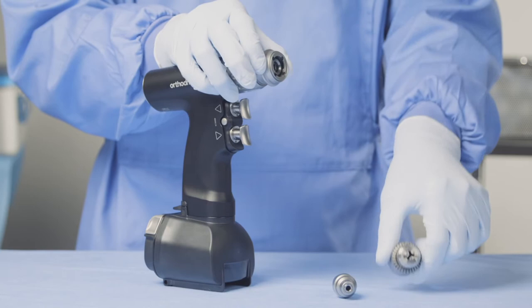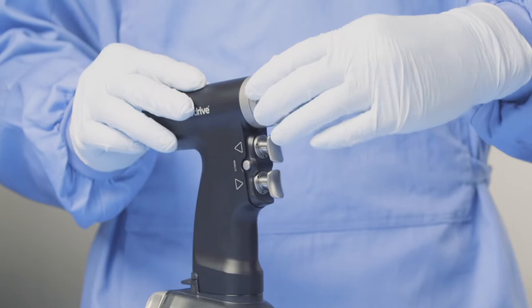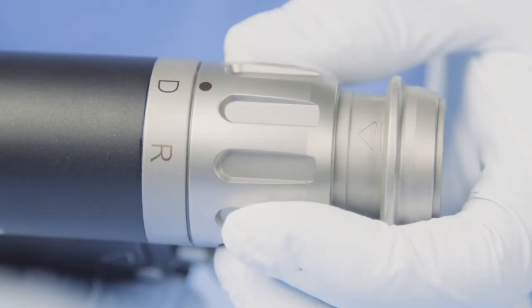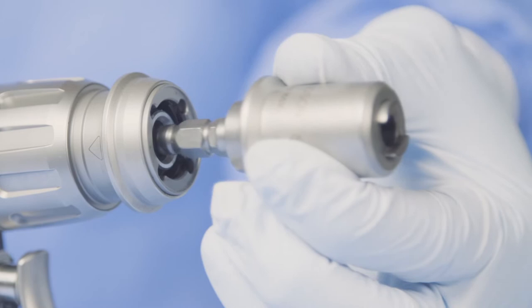To attach a reaming handle to your MBQ handpiece, firstly, place the tool into safe mode and turn the drill into reaming mode by twisting the collar from D to R. Then you can take an appropriate attachment, such as this Hudson attachment, and place it into your tool with a push and click.